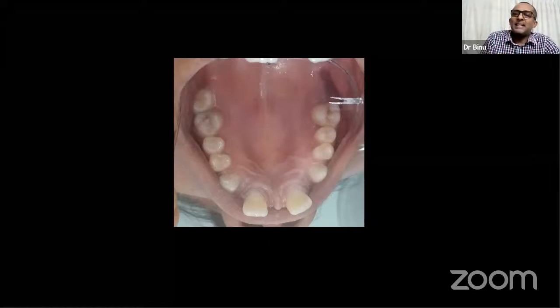What is that? Can you see the scratch there? Scratched mirror. The biggest problem with these mirrors is scratches. The scratches will be highlighted. Another big problem is fogging. The moment you put it in, it fogs.